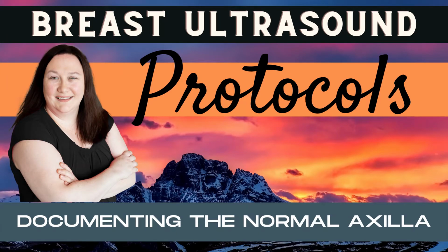Let's document! Join me as we cover breast ultrasound protocols. On today's edition, documenting the normal axilla.